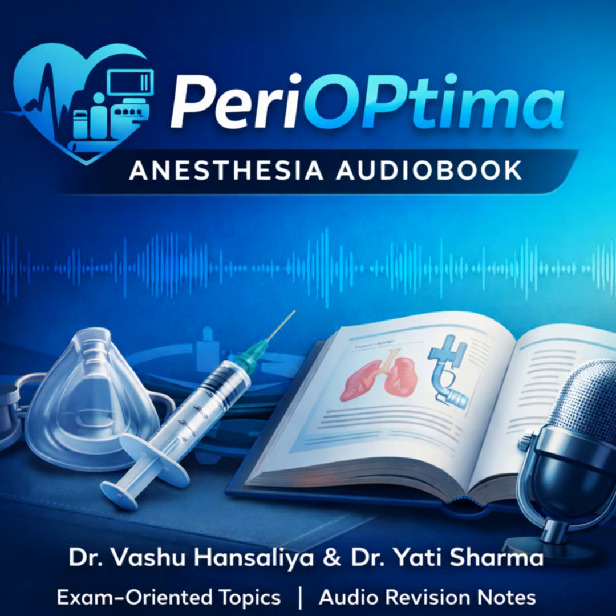And can you give us the high-yield configurations, the ones we absolutely need for the exam? Yes. You must know these. The positions are standardized, 1 through 7. Oxygen is indexed at positions 2 and 5. 2 and 5 for oxygen. And nitrous oxide is indexed at positions 3 and 5. 3 and 5 for N2O.